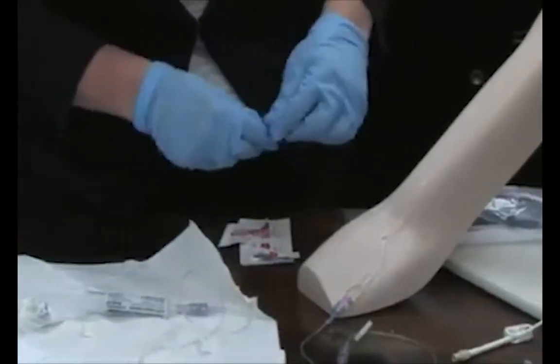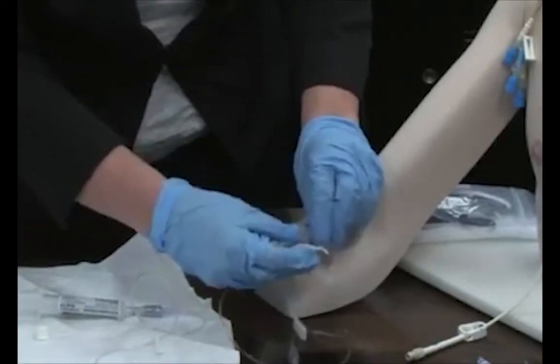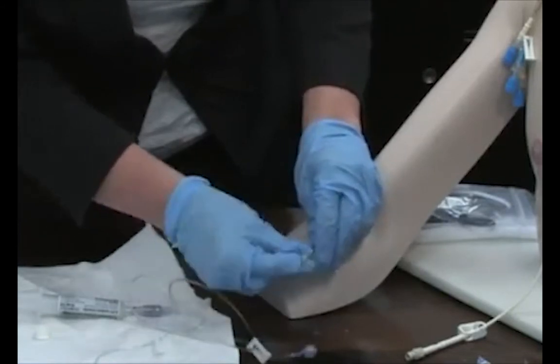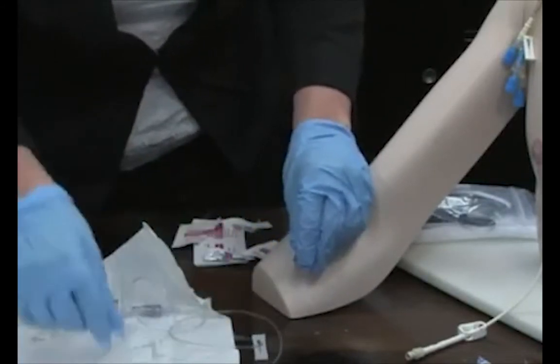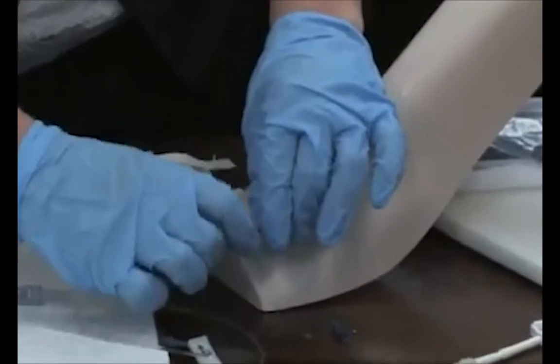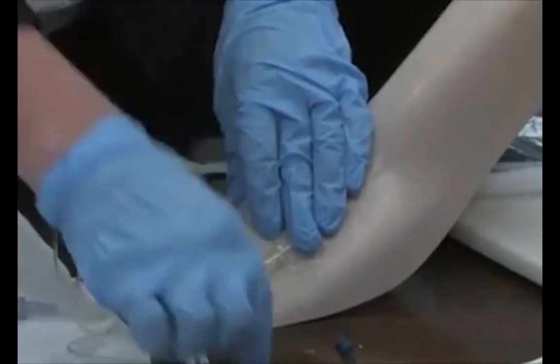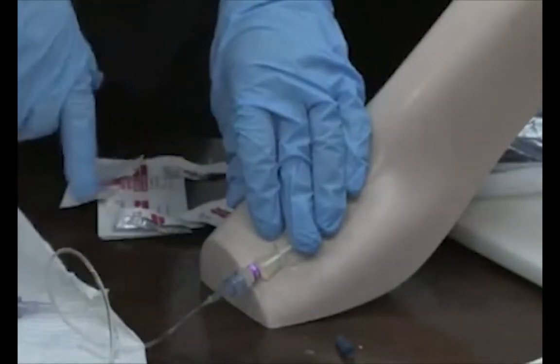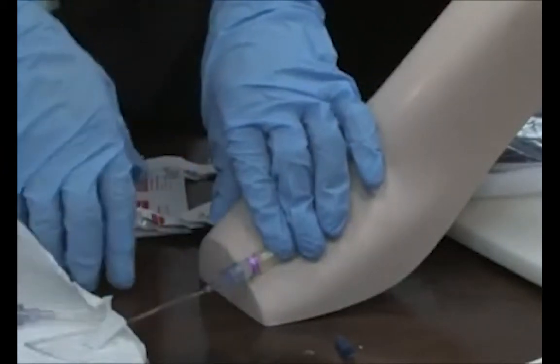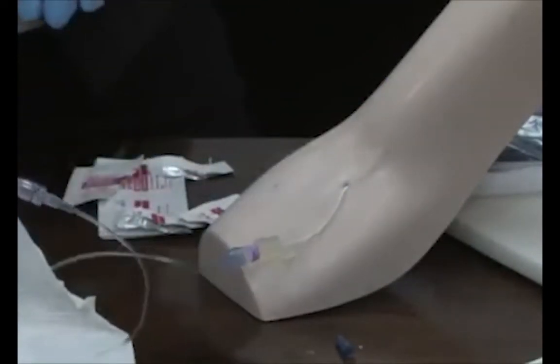Then you get another alcohol pad. And you're going to remove the extension set, wipe the end with alcohol, and put on the new one. And an important thing to note here is you don't want to put this on so tight that the next nurse cannot get it off. Some people just really torque it, and it's very, very difficult to get off. And that's how you change. You, of course, would flush.